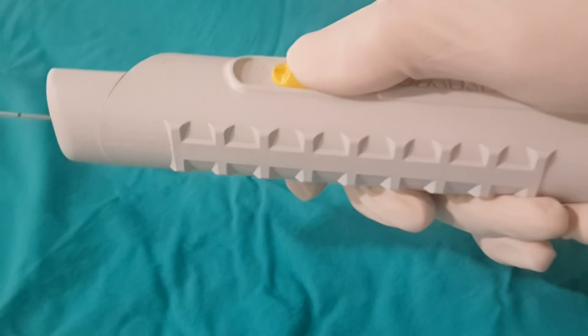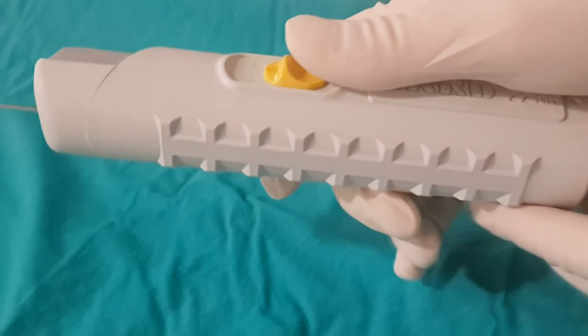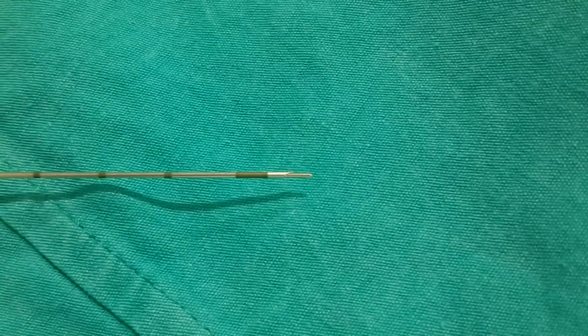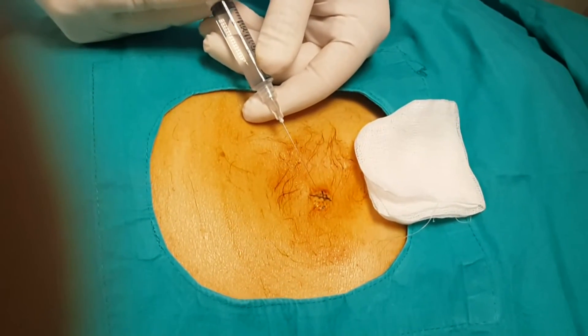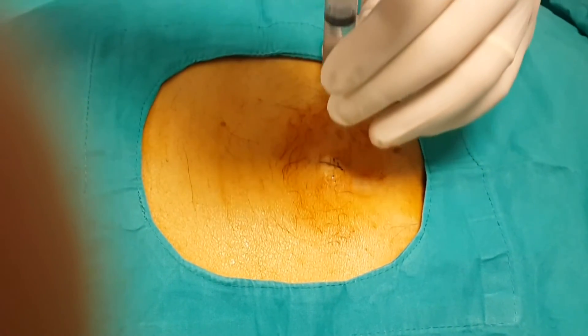The coaxial needle is a fully automated true-cut biopsy needle. When this button is released, the needle makes a sudden forward move and cuts a piece of tissue off the mass. For percutaneous biopsy, we first numb the skin. We also numb the peritoneum, which is a membrane that lines the abdominal organs. After this stage, the procedure will be totally pain-free.